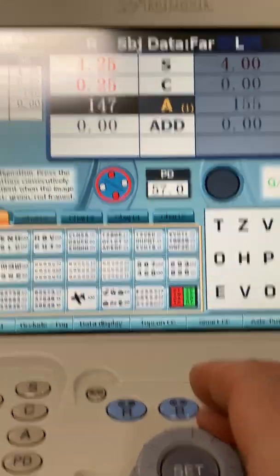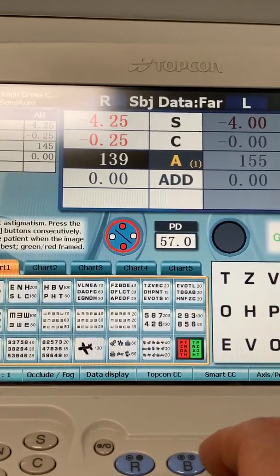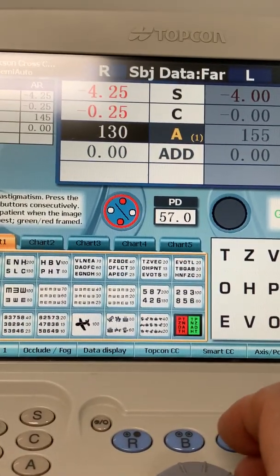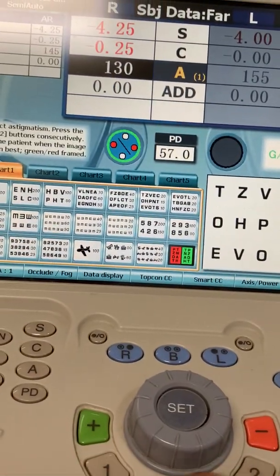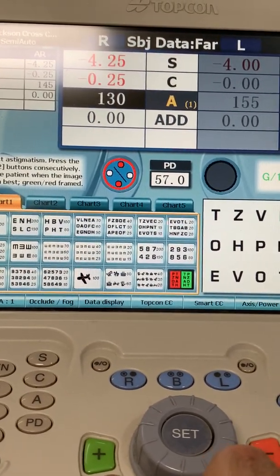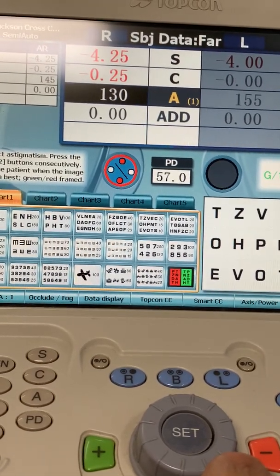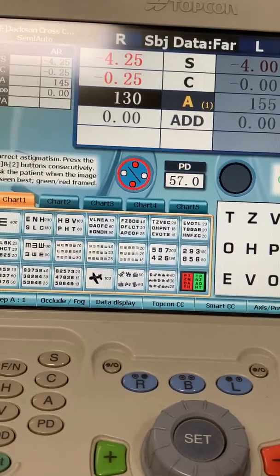We turn the knob — if the patient likes number 2, we turn the knob in the direction of the little red dot, however many degrees we want to go, like 10 degrees. Then ask which is better, and go back and forth. Sometimes the patient sees a little glowing of red or green; I tell them to ignore that. I say just go by what I'm telling you: which is better, 1 right now or 2 right now.